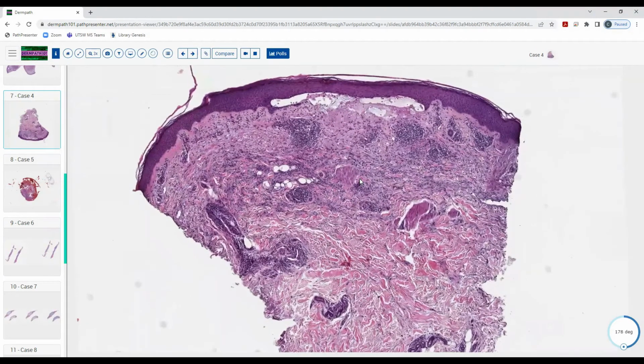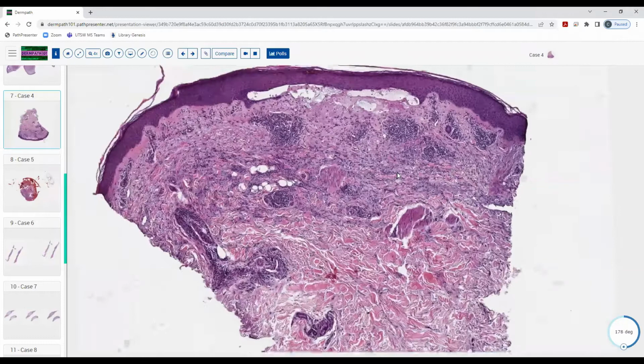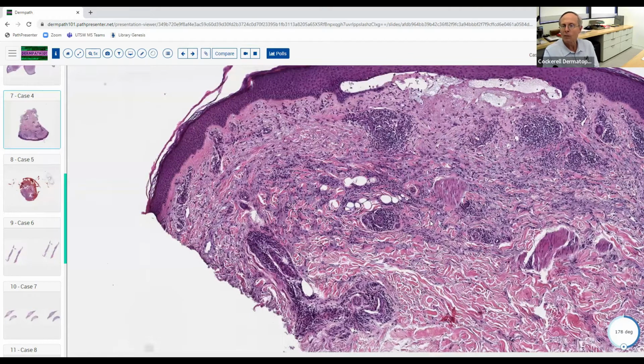So there's a dense inflammation in the upper dermis, closer to the dermal epidermal junction. There are almost lymphoid aggregates forming. Good. There's also vacuolization with some probably serous fluid at the dermal epidermal junction. This is interesting because this is probably somewhat of an artifact, although this disease can occasionally give you some secondary epidermal changes. But the bulk of it, I think you're correct, is in the dermis. And you've got this perivascular infiltrate of lymphocytes. Was there anything between the blood vessels down in here?